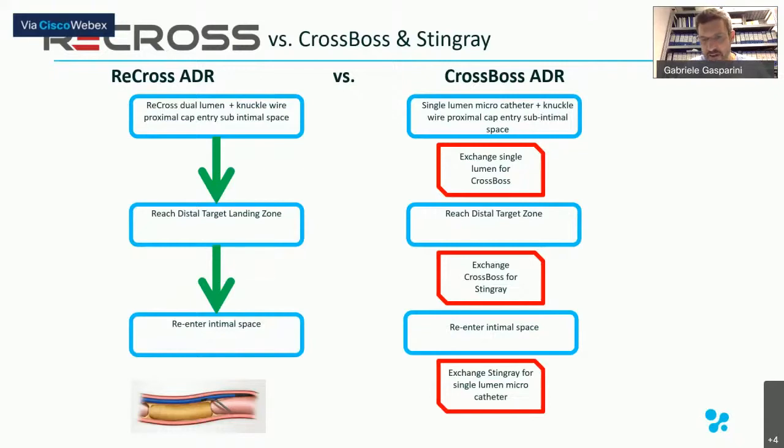So there are several steps using the CrossBoss device, and you have to know how to use it. It's not really simple. You need a certification to use the Stingray system. But the same concept could be done using the Recross system as a re-entry device.